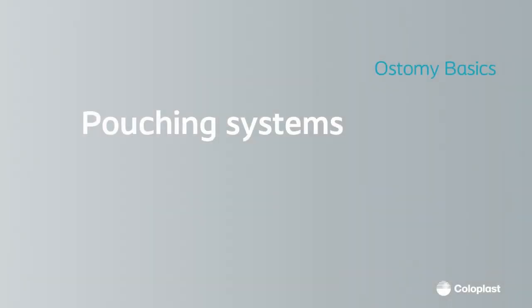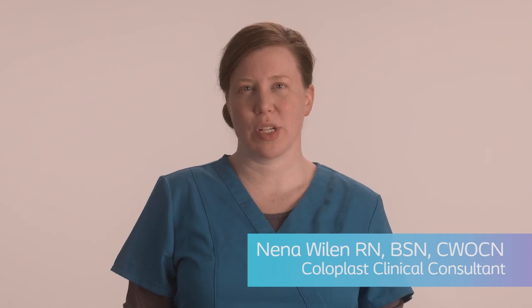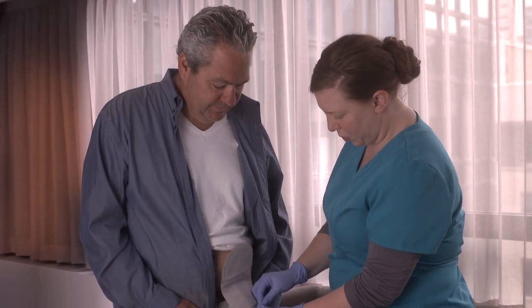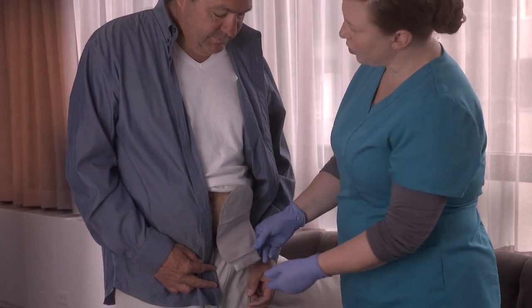This module will cover the components of an ostomy pouching system. During the postoperative period, you may need to select an ostomy pouching system for your patient. It is important to explain the rationale for the pouch selected because their pouching needs may change as the abdomen and stoma change over time.